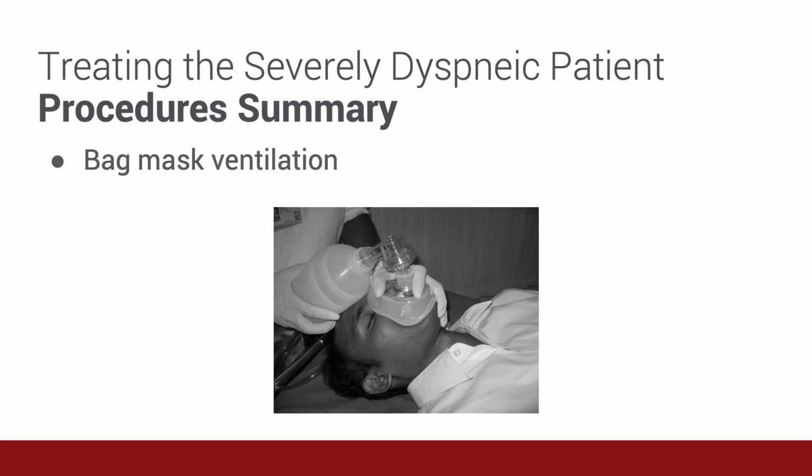Effective bag mask ventilation requires selecting an appropriately sized bag and mask. Creating an excellent mask seal with the appropriate one or two provider mask grip, paired with an effective airway opening maneuver, are essential steps to successful bag mask ventilation.